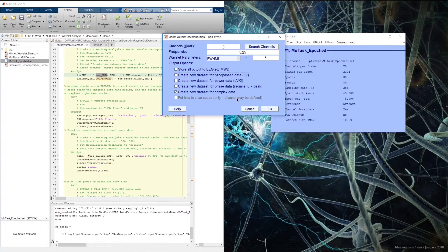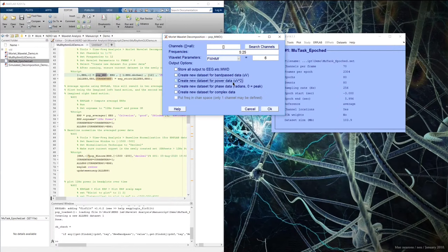The reason it's set up this way is because EEGLAB data matrices are only three-dimensional, containing channels, times, and epochs. If you're going to be working with a lot of wavelets, you really should drop out of the EEGLAB GUI environment altogether and use the standalone MWD function included with this package, which will add a fourth dimension to the data matrix for frequency. To compute the mu desynchronization, we really only need the power data, but I'm also going to include the phase and bandpass data just to show those as well.